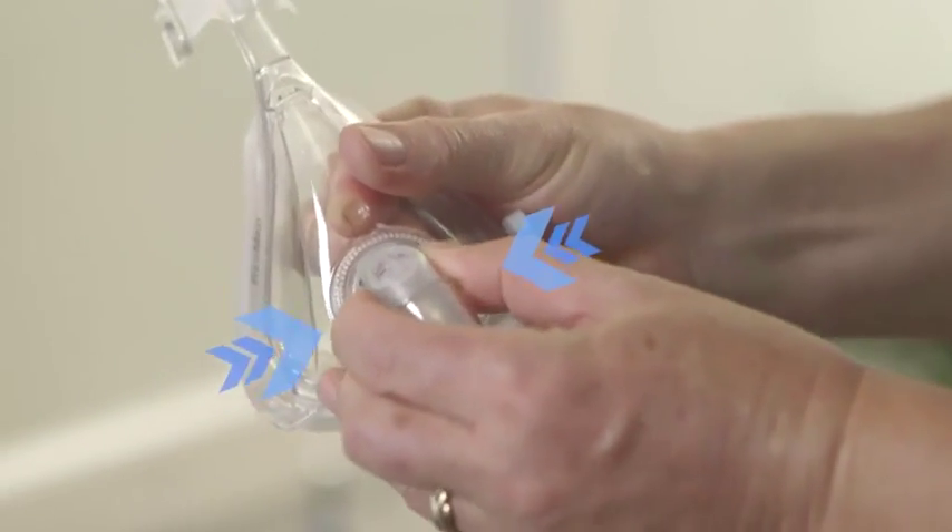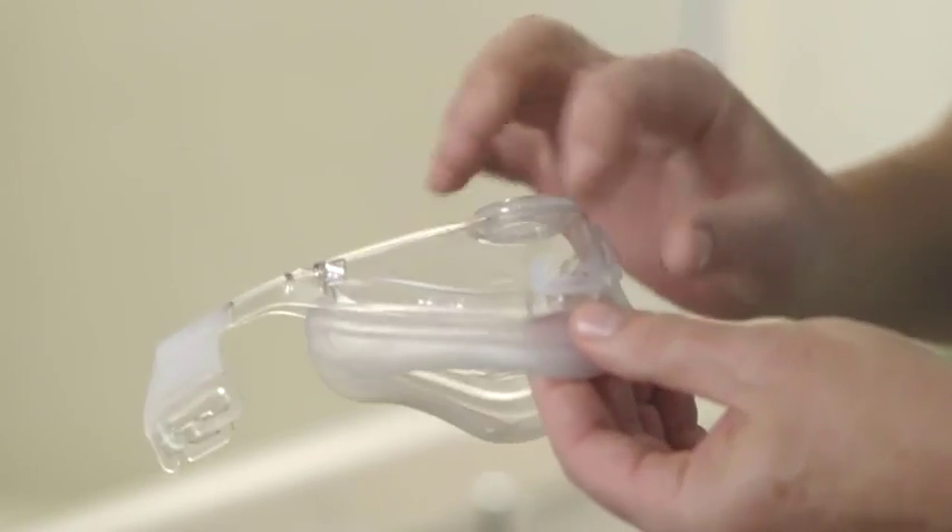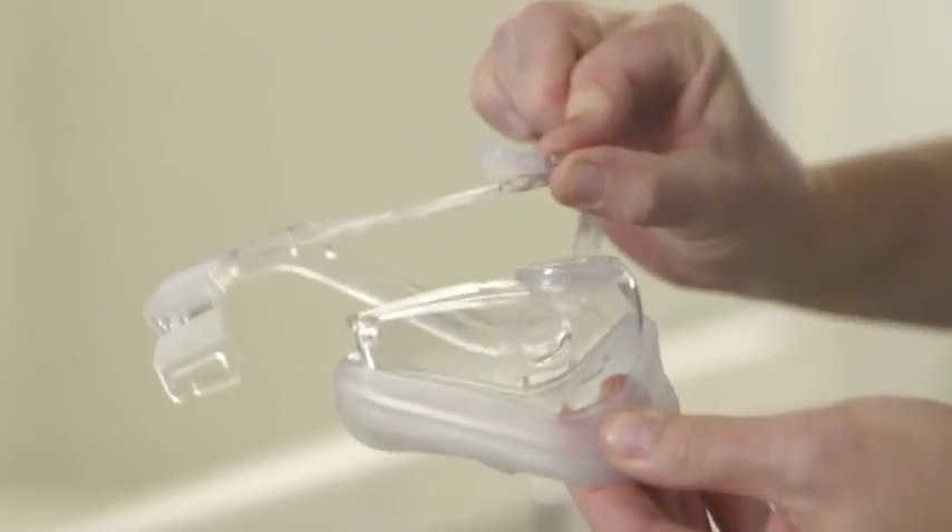Now squeeze the side buttons of the elbow to take it out. Then unclip the cushion from the frame, like this.